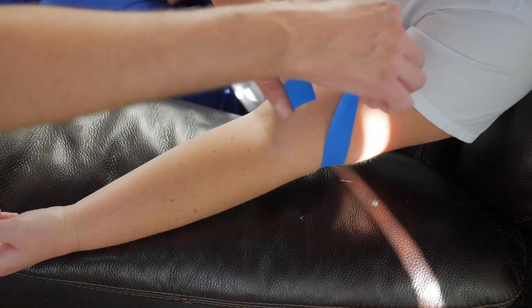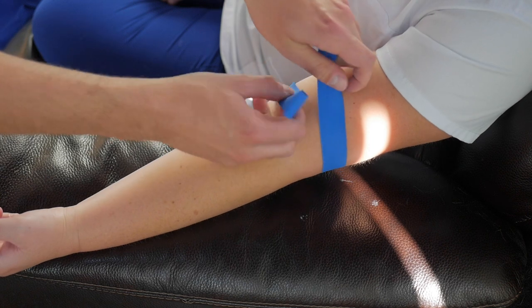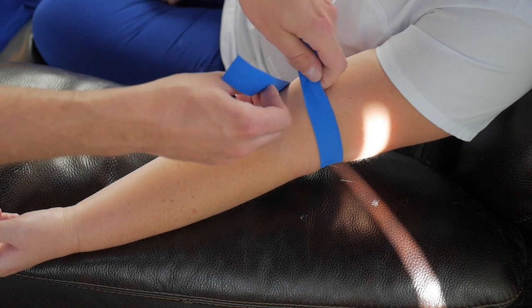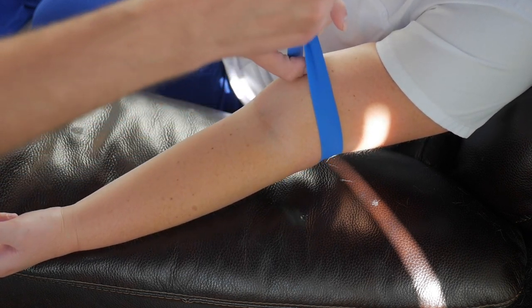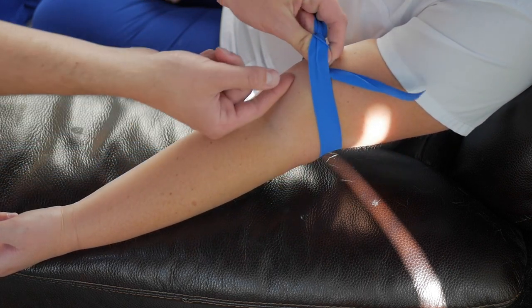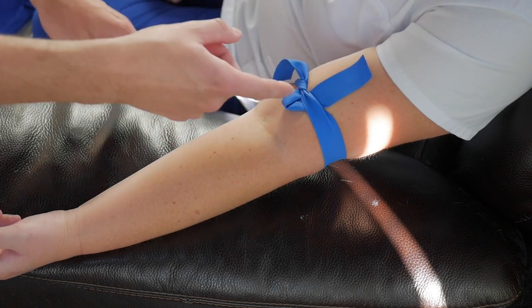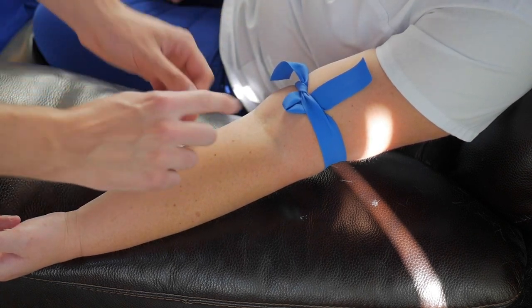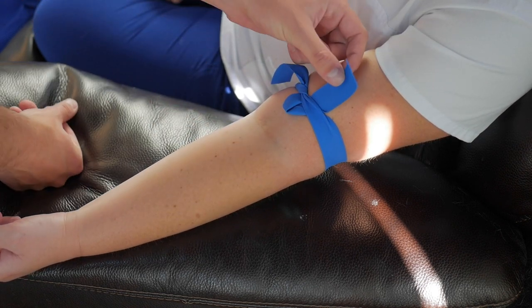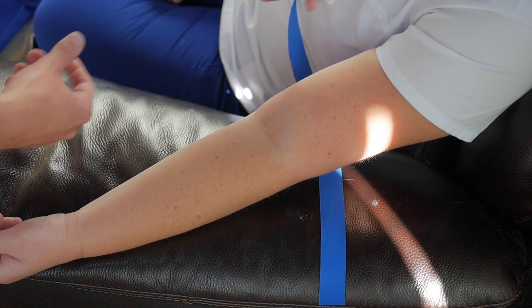You're going to take this and start by just laying it like that. Grab each end opposite to where it's coming around the arm, give it a little bit of a stretch, cross this one over and then pull it under like that. This is a nice quick-release knot — the vein will be coming up and you can feel it, and when you're ready to get rid of it all you have to do is pull right here and it'll come undone with one little pull.